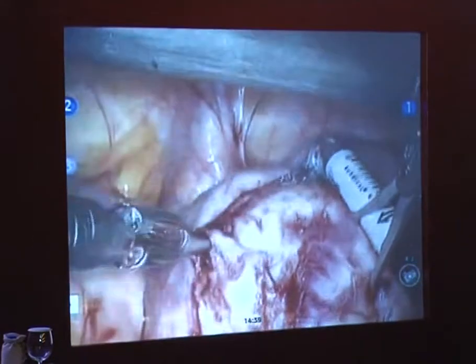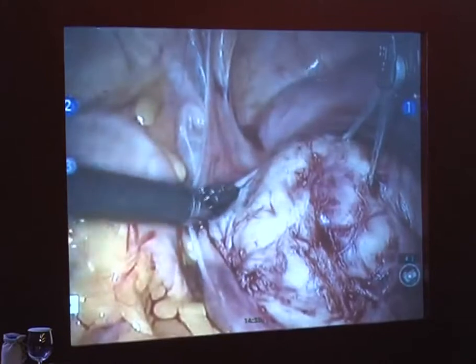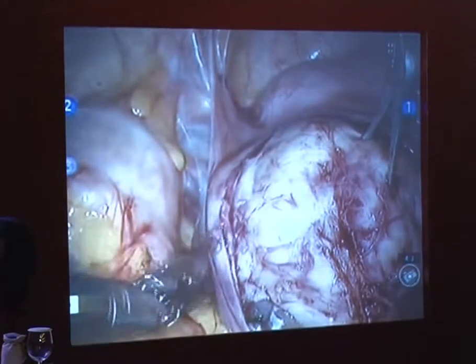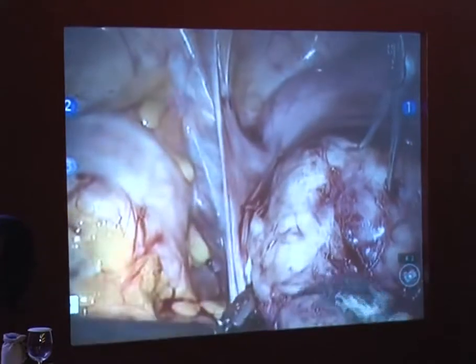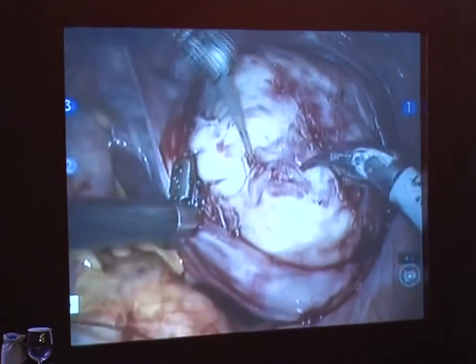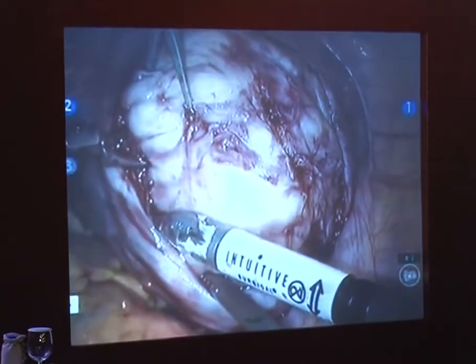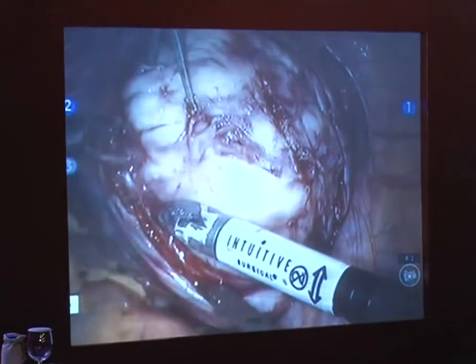so used to using an Si, I'll be honest with you, which is really very streamlined in terms of how you clutch between your fourth arm, or quote-unquote third operative arm, and your second operative arm. But in this case, on the S system here, we don't have the cable to integrate the bipolar with the Da Vinci. So I'm actually having to take my feet outside of the console in order to find my pedal. That creates an inefficiency when you have to do that, because you get used to muscle memory of where you put your feet when you do these cases.